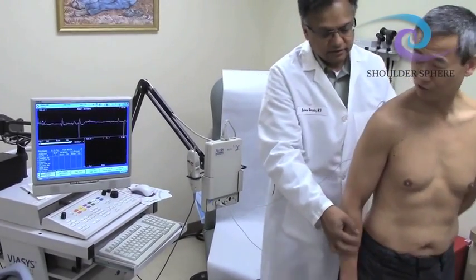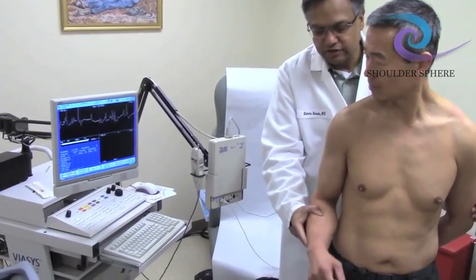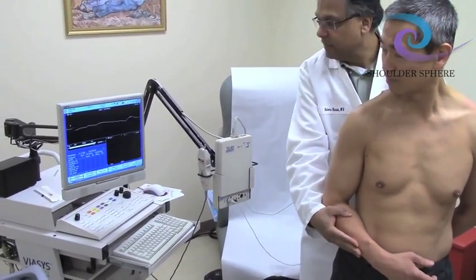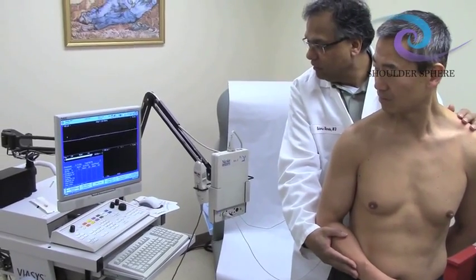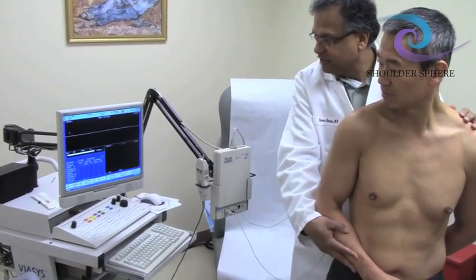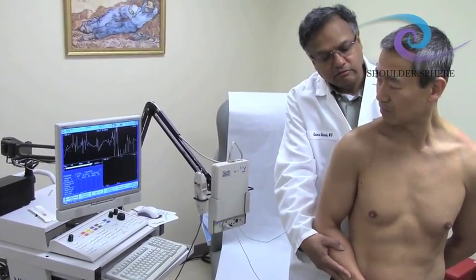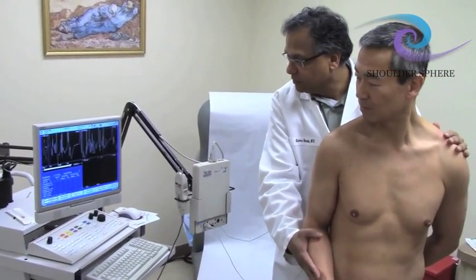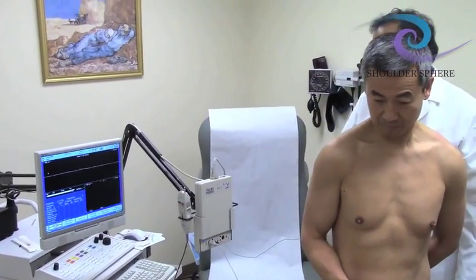Looking at the screen — very interesting. You can actually get good feedback this way. Let's do external rotation, that might be easier. You can see it fires during the push, and stops when you let go. When you just elevate the shoulder, there's less activity — that's the trapezius. This is to make sure we're in the infraspinatus, not the trapezius. We isolate it: push out, and this confirms it is the infraspinatus — a normal muscle — and at rest there is no firing.